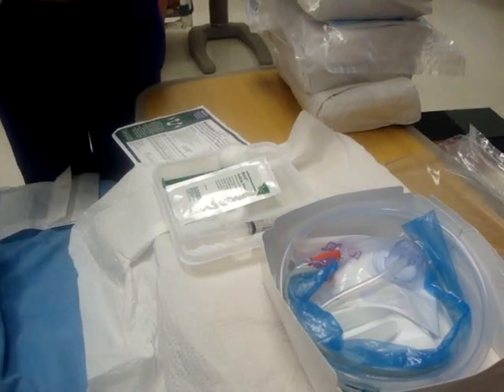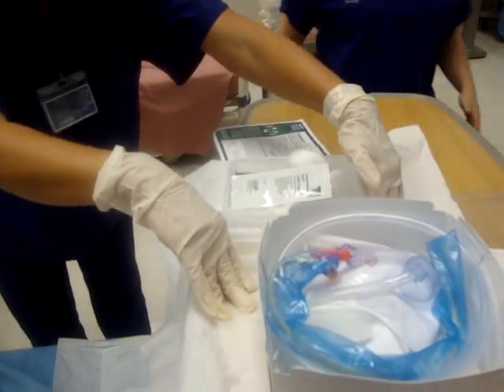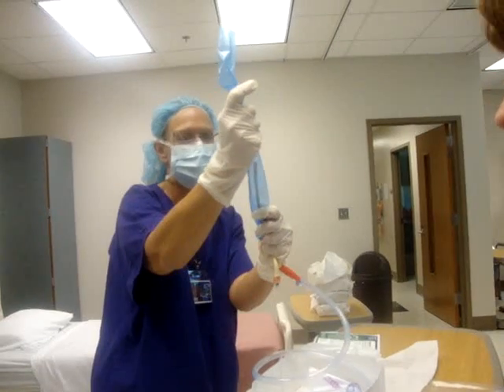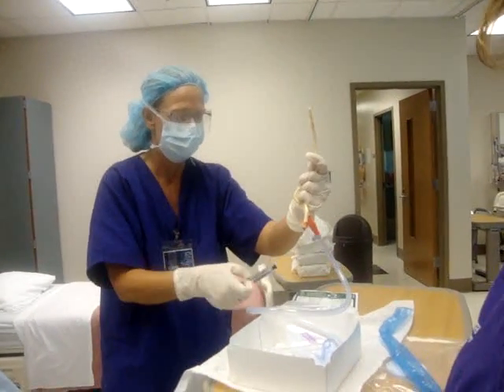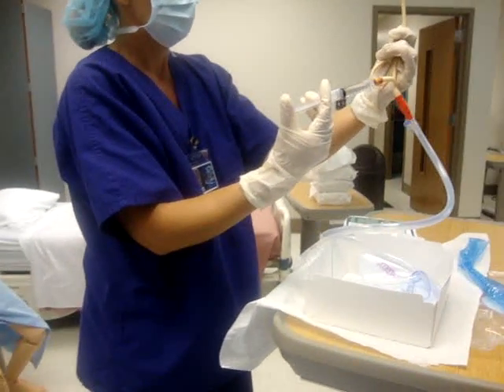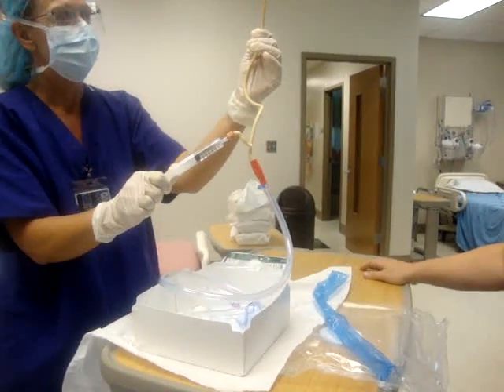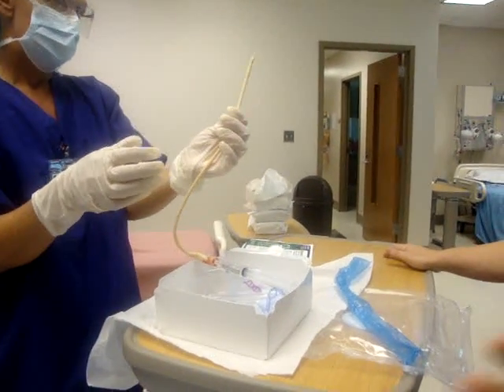I would have just lifted this whole thing out first so that I can get to my Foley. So the first two drapes — there you go. When I've seen a catheter done, they didn't do any of this — but it was in the emergency room. This is the right way to do it. Are you going to see people not use the drapes? Yes, but this is the correct way to do it. We're not going to teach you the quick way. In the OR every day they're not using any of those drapes, but it's just knowing what they don't always do — and we know how to do it correctly.